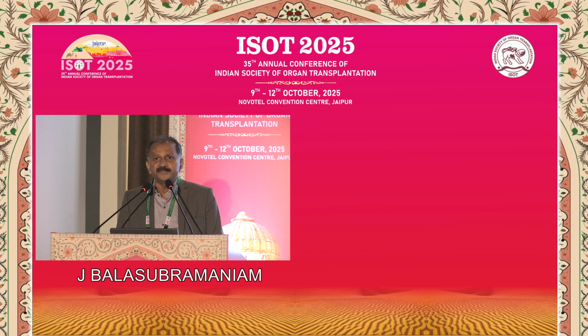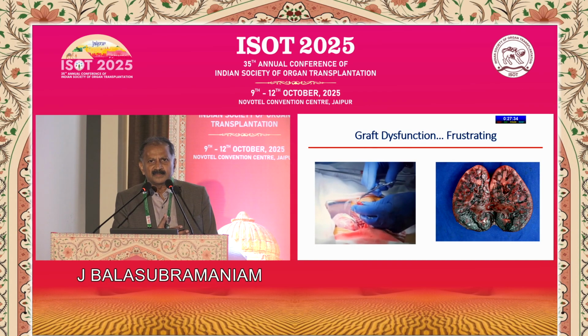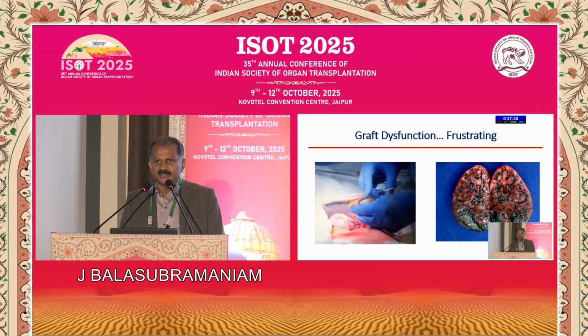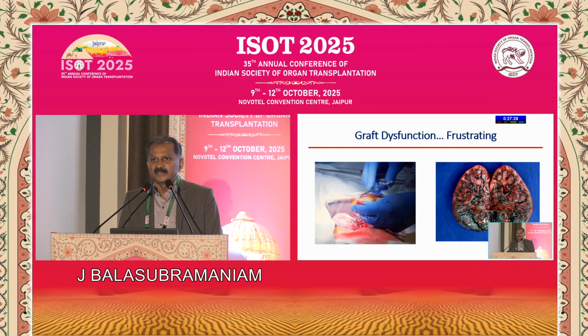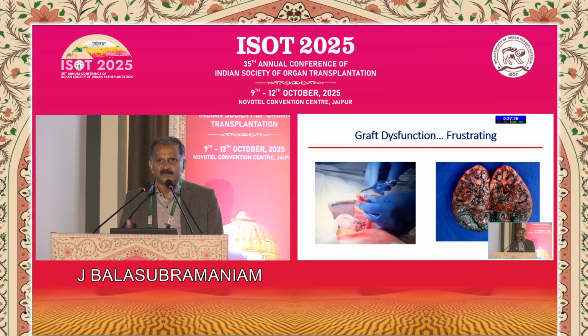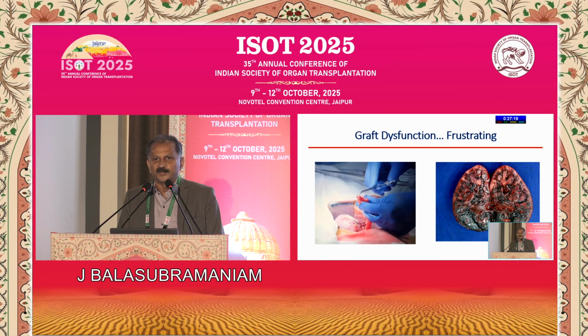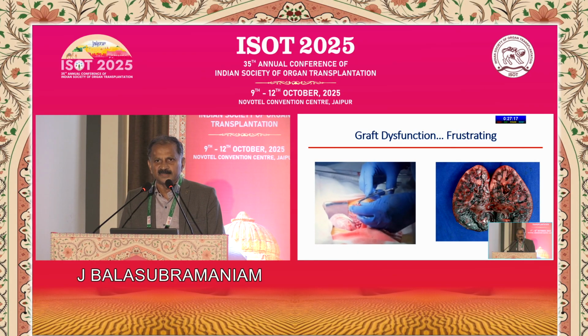So here, nothing like seeing a functioning graft, and for every nephrologist in the theater, it can be equated only to interventional nephrologists who are doing angioplasties or AV fistulas when they have a good flow when they release the clamp, and it gives such a pleasure to see a functioning graft.